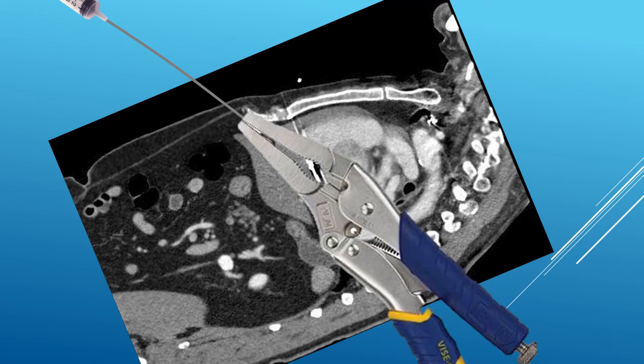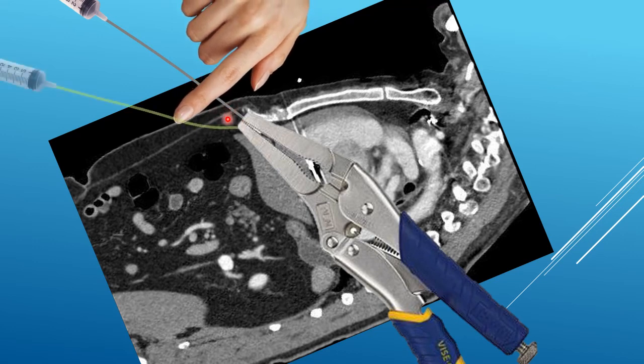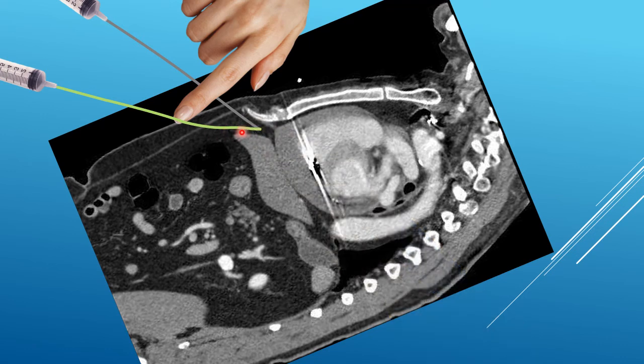So what do we do? Instead of lowering the syringe, we put pressure with our hand that's resting on the patient, pushing down the needle closer to the surface of the skin, roughly in the middle. The skin will stretch slightly, and that will push the bend of our needle down. The fact that you're much closer to the place you want to move it means that you're much more likely to be able to change the track of the tip of the needle. And now the tip of the needle is going in at a 30-degree angle. We don't need to worry that our syringe is at a steeper angle.